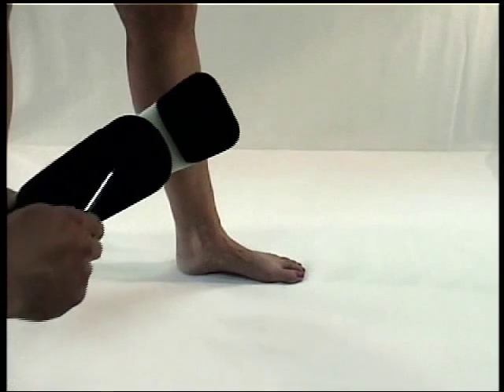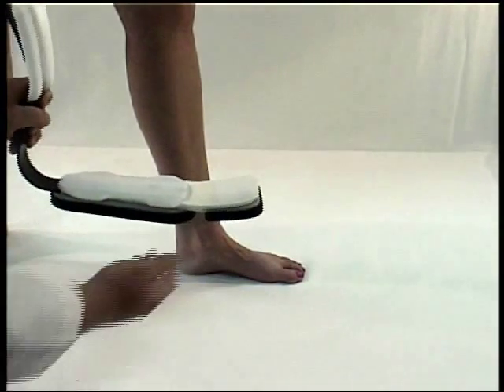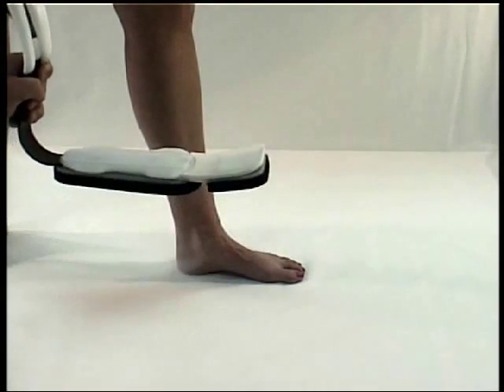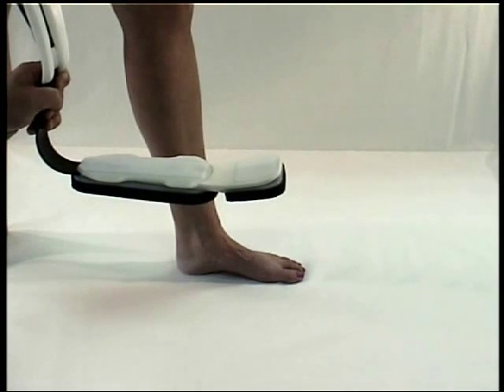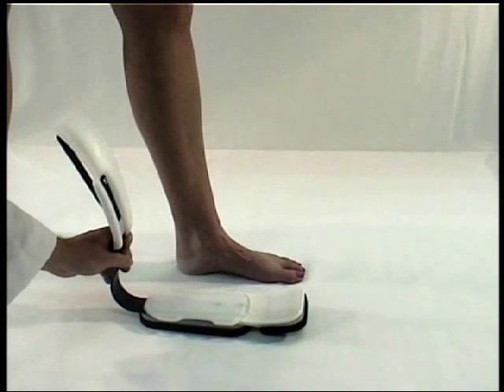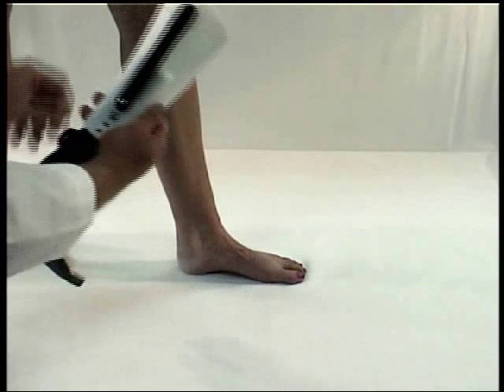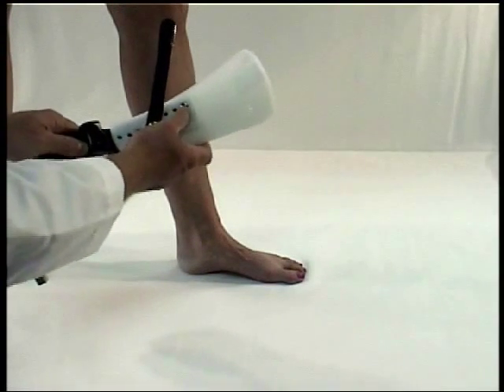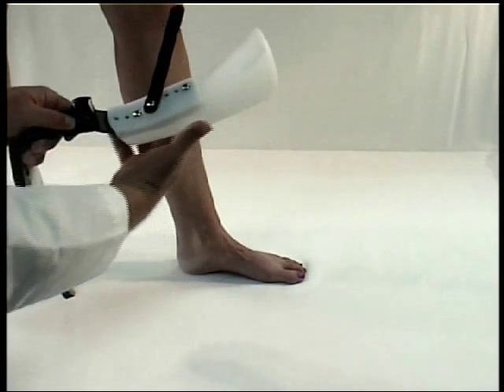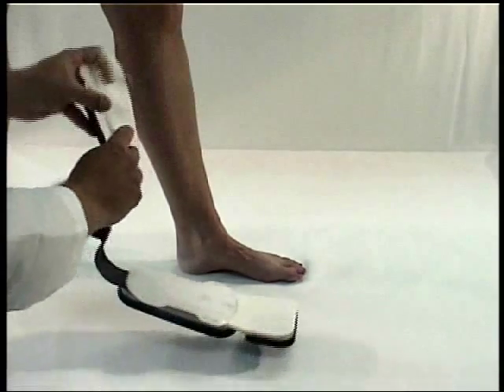Begin adjusting the foot length by loosening the two distal screws found on the plantar aspect of the walking base. Simply slide the toe extension distally or proximally and cross-reference your final measurements accordingly. Be sure to retighten the screws securely after the adjustment is made. To adjust for the calf height, begin by loosening and removing the two attachment screws and detach the calf segment. Approximate the correct height position according to your measurement and reattach securely.